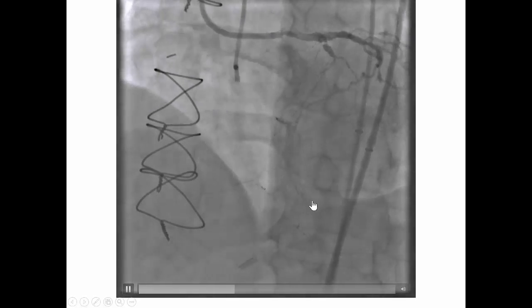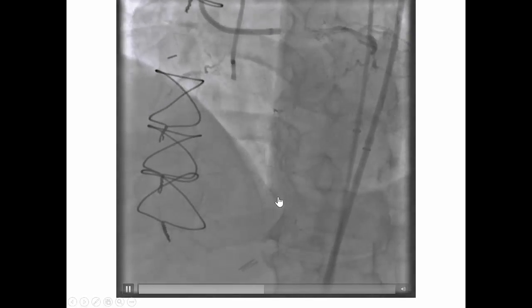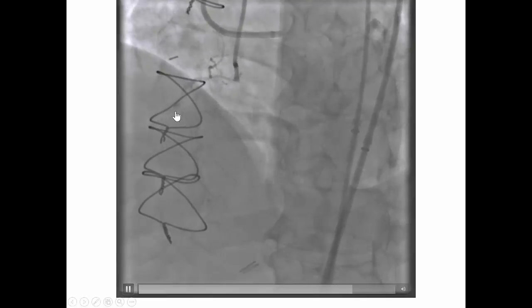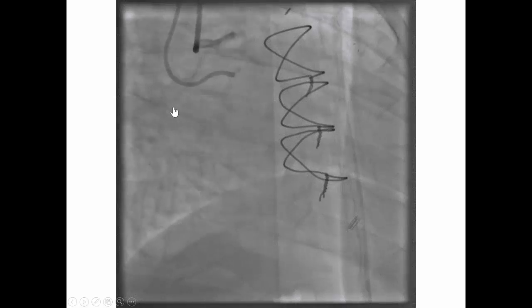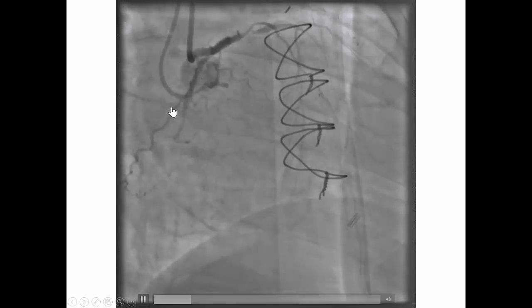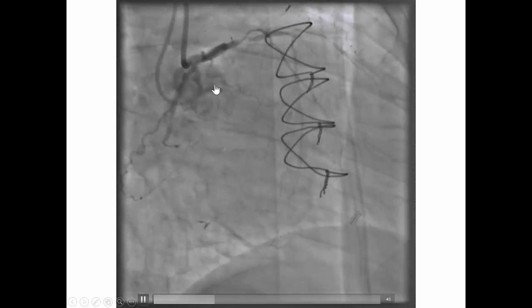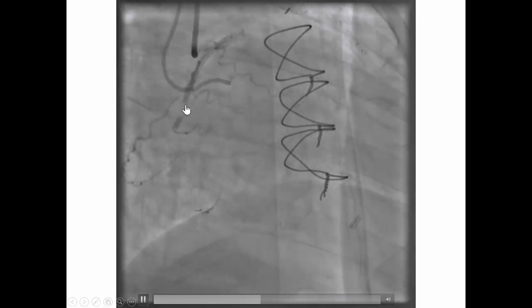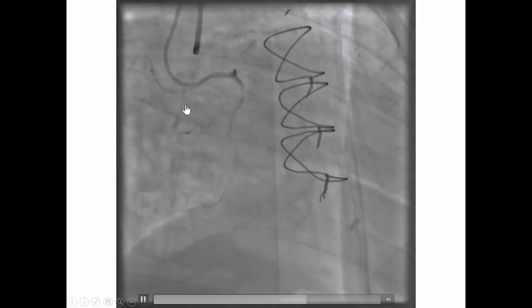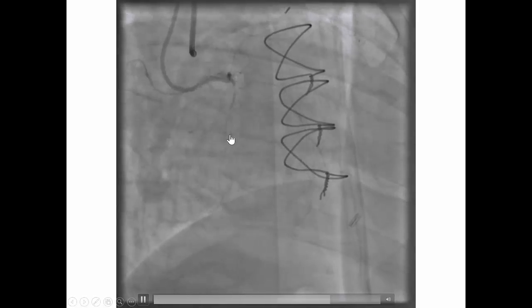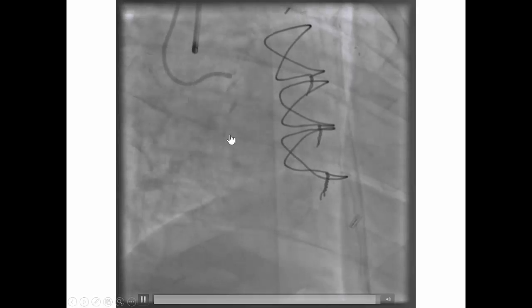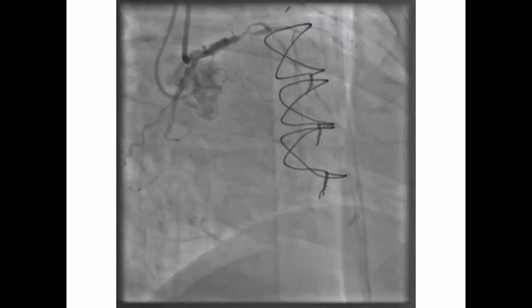On a different view, we see some septal collaterals filling partially the PDA. The distal vessel is diffuse and diseased, as is the proximal vessel. On the RAO view, there is a fairly well-defined proximal cap, but it's a very small and diseased vessel.